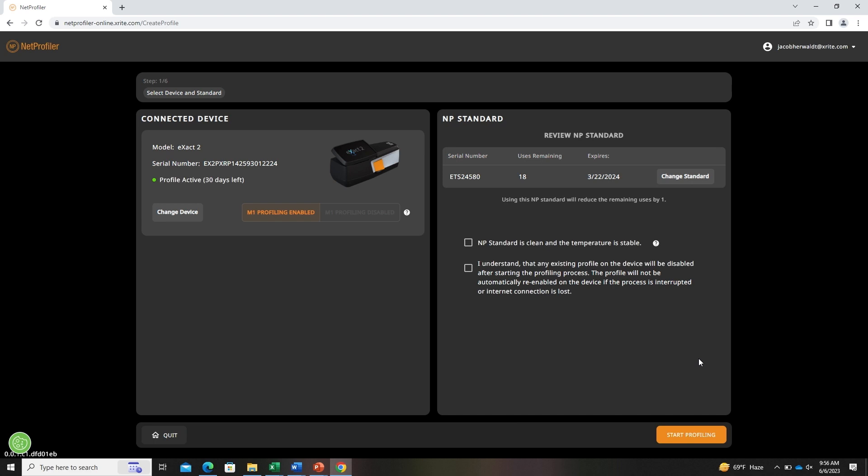Next, make sure that the standard is clean. Do not wipe the standard but blow it off with air if needed.